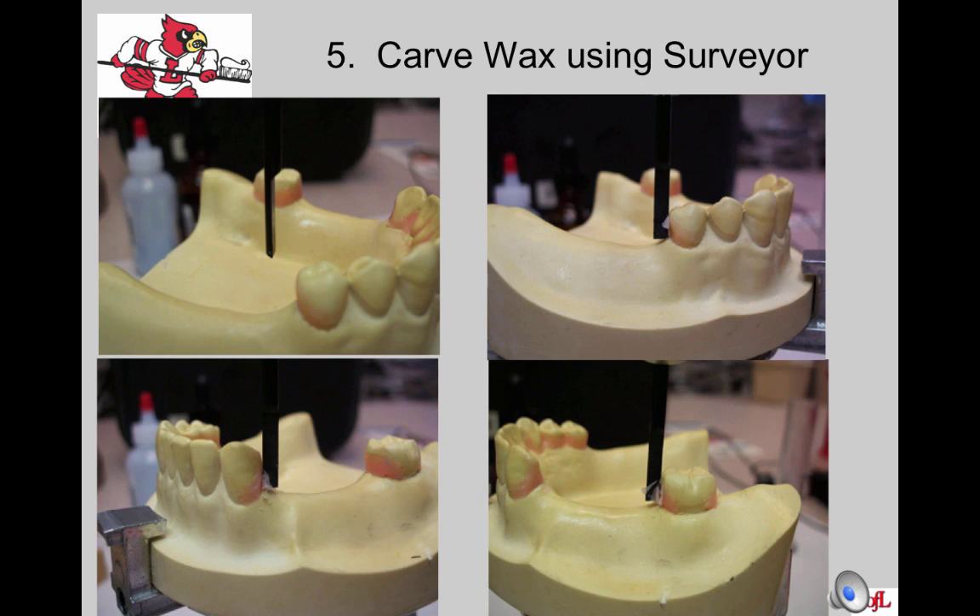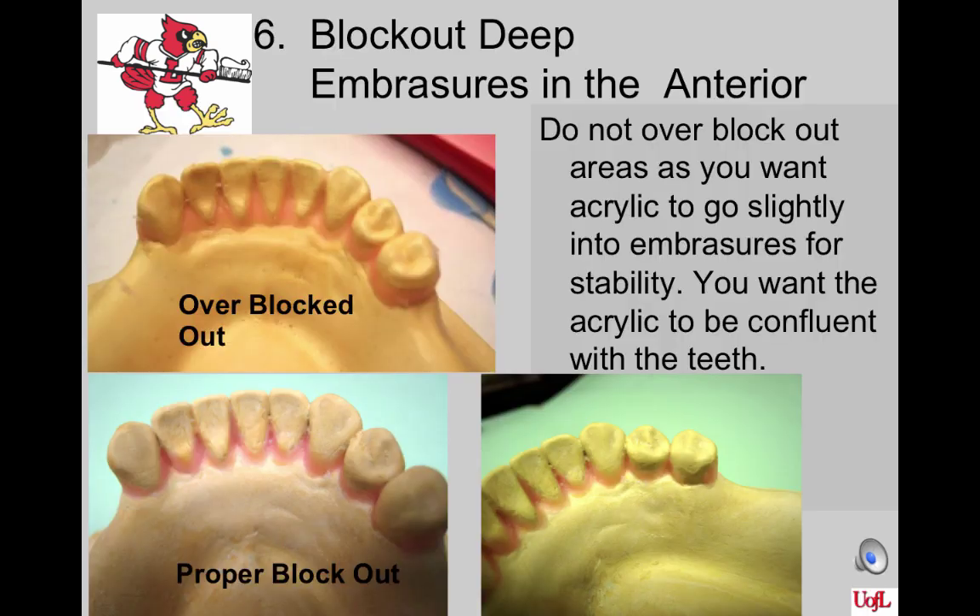Place the wax carver into the vertical rod of the surveyor and use it to trim excess block out away. This prepares the surface parallel to the path of insertion and removal, making your final base plate very stable. You want the base plate to rest above the survey line on the support area of the teeth, not on the wax. Take care not to cut off the stone surface of the teeth — otherwise, the base plate will fit on the cast but will not seat on the dentiform, which is your patient. Block out the embrasures in the anterior, but do not overblock them, as you want the acrylic to go into the embrasures for stability.